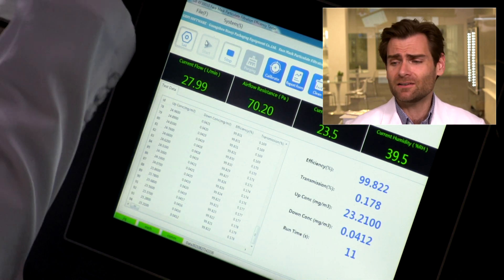Big idea here is we are testing filtration, not the fit. You need fit and filtration for a good mask, right? But if the filtration is bad, the fit doesn't matter. That's why we're doing this for you — because you can probably figure out if a mask fits, but you're not going to be able to figure out if it's testing well.